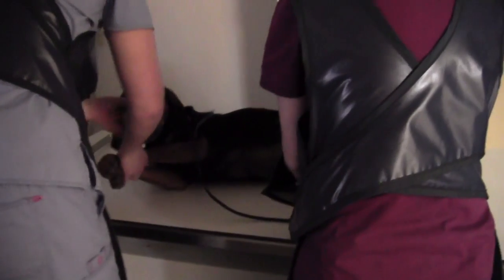When using an abdominal x-ray to assess the liver, you should use this lateral view. If you are assessing a vomiting patient, you should use the left lateral view.